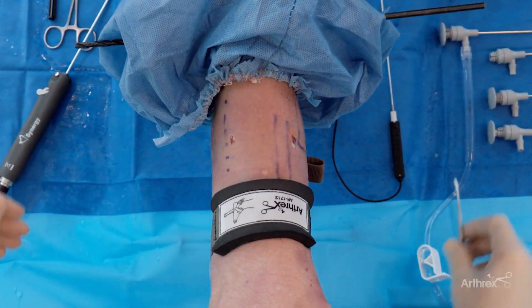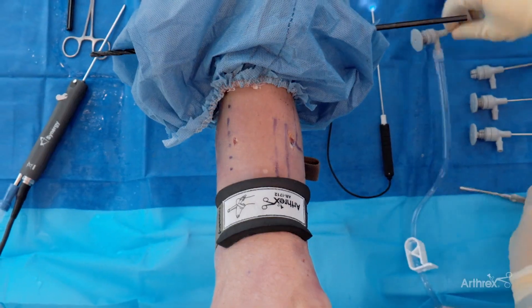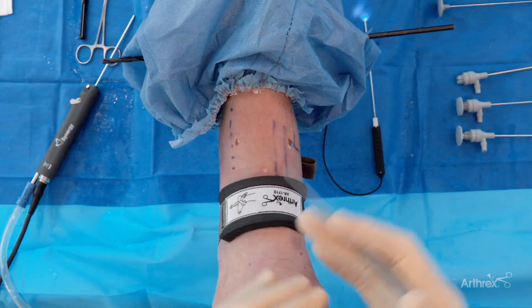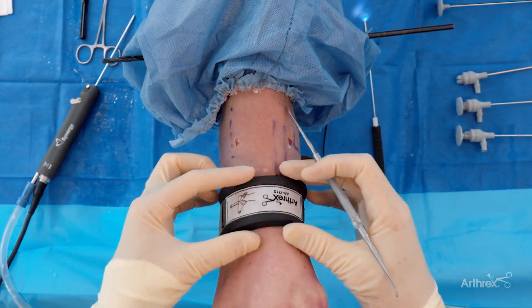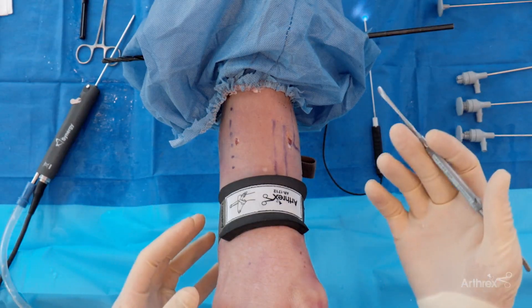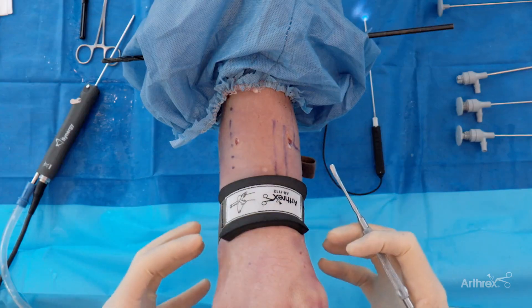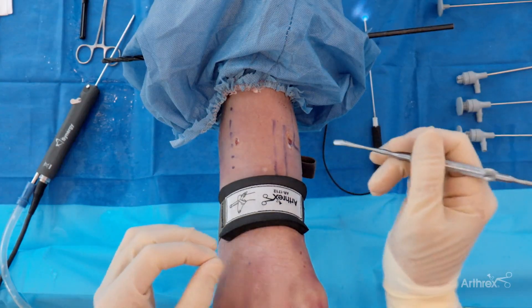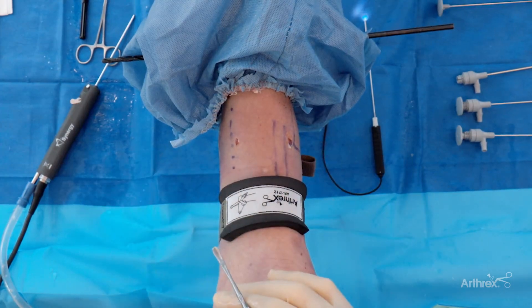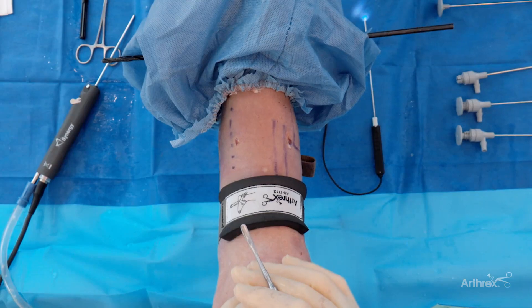We're going to insert and show you a little bit on the inside of the joint. Before we do, let me highlight just some portal placements. I always use a distractor for most of these cases, but on that note, if it's a trauma case, you're not wanting to do all of that. The ease of just putting this in with a needle and not having to do all the setup of a distractor is one benefit to using the Nano needle.